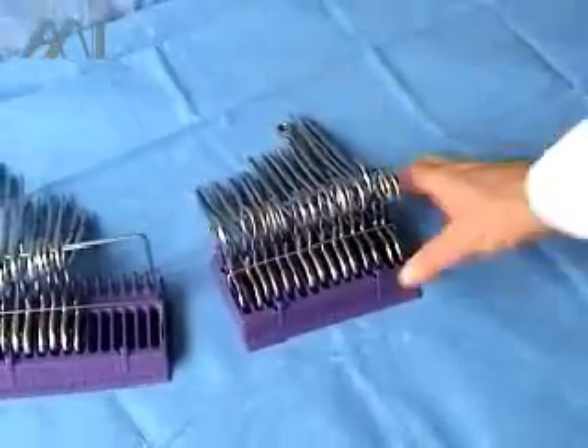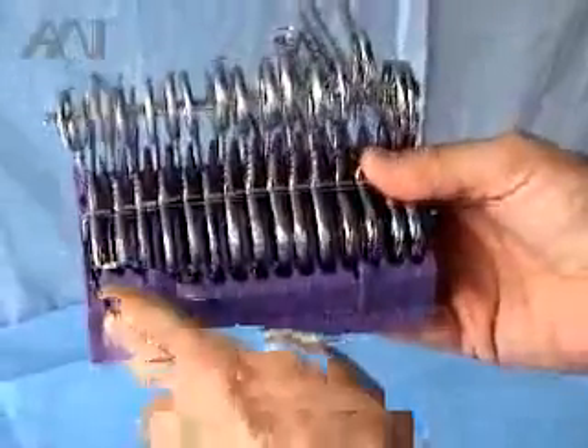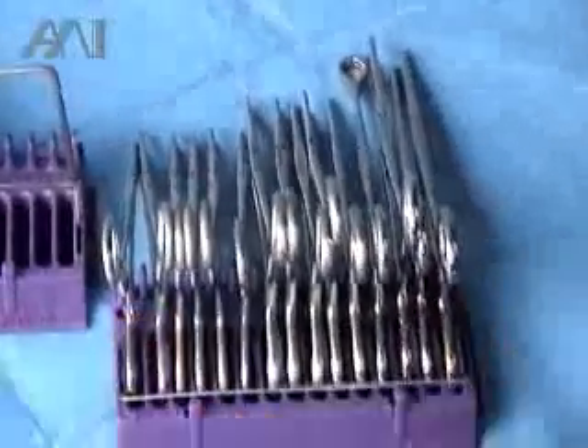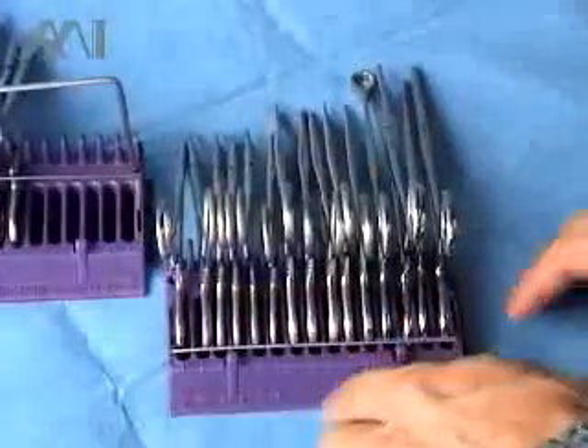Our system is an instrument counting and organization system. It's a rack with 15 instrument slots. The way this is done, very simply, is in the instrument room, where the instrument technician deposits all the instruments one by one into each slot.